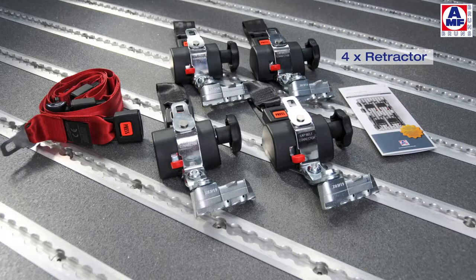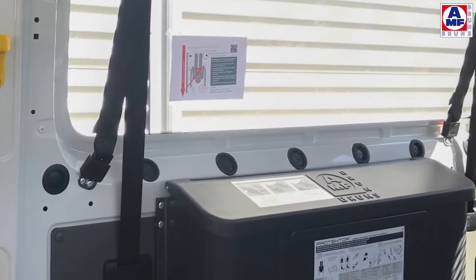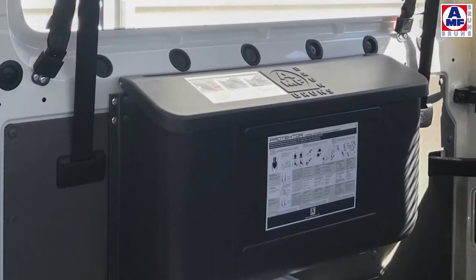You need two retractors for the front anchorage and two for the rear anchorage, plus one pelvis belt and one shoulder belt installed in the vehicle. All loose components should be stored in the appropriate crash-tested storage box.